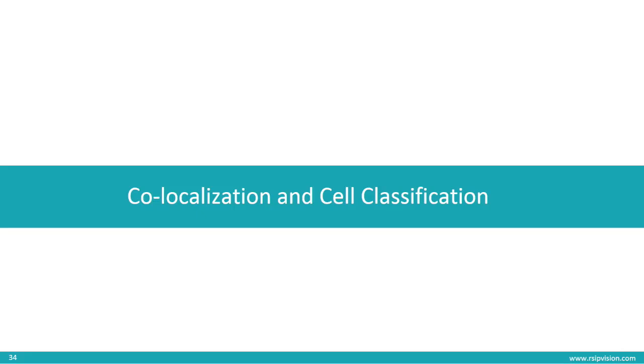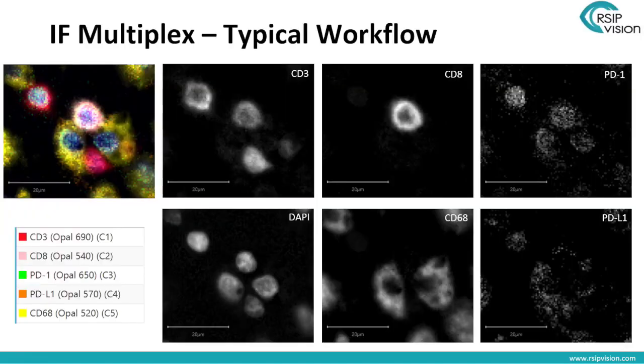What's called in this profession colocalization. So this is a multiplex image, which means we have multiple dyes that are fluorescing in different wavelengths. These are captured. It comes to our algorithm as an image with multiple channels. The colorful image is just a way of displaying it. Typically, the way these cells are classified, you have a pathologist who knows what they're looking at. They know what they're looking for. They can explain it. They can train an annotation team to reasonably annotate this.